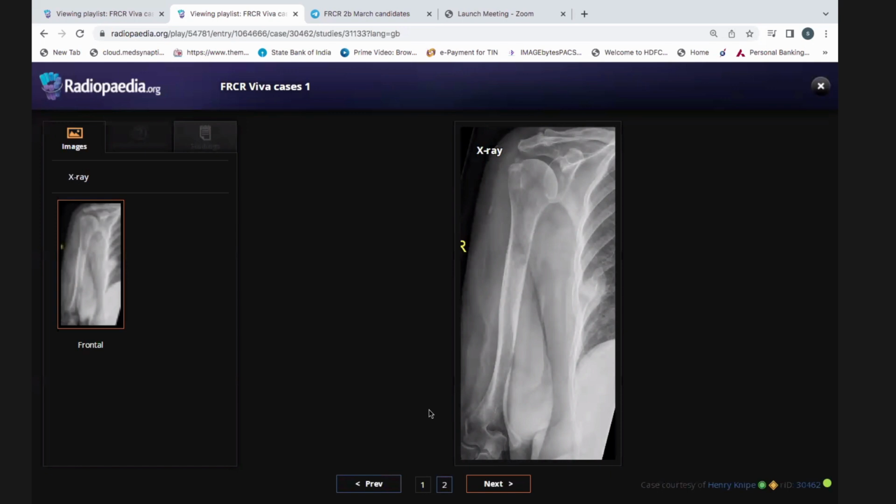In my routine practice, I'm checking if there is any previous history, and I will recommend a dedicated chest radiograph study to narrow my differential, which is maybe brown tumor, maybe enchondroma, maybe fibrous dysplasia or metastasis, and informing the treating clinician for the next step.